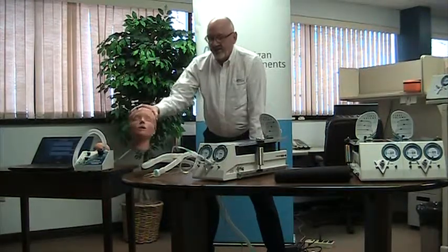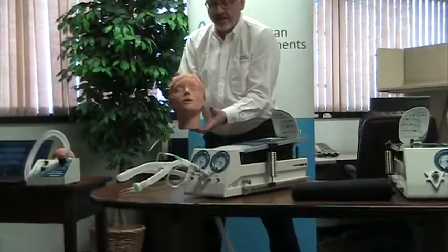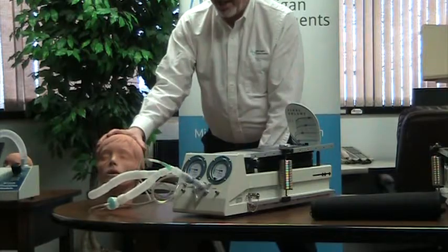The head simulation module is another accessory that can be added to any of our test lungs, and that further expands the applications.